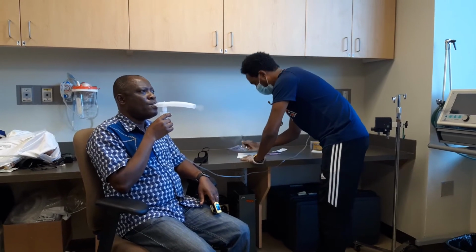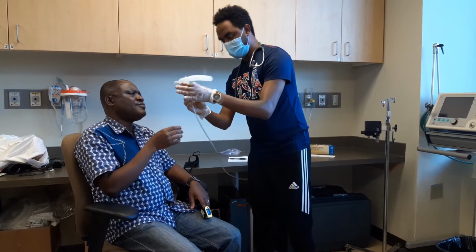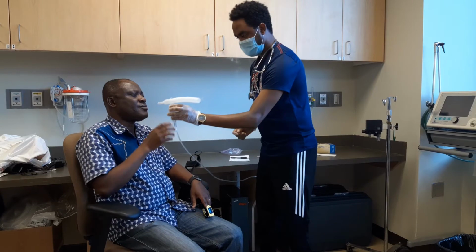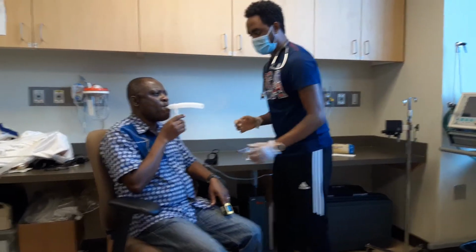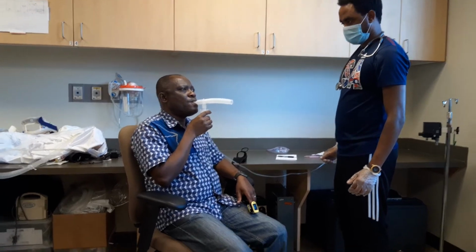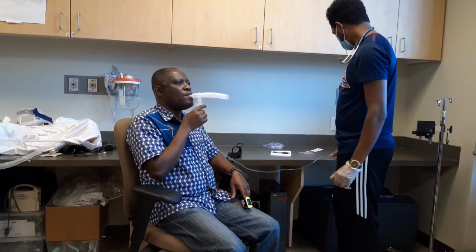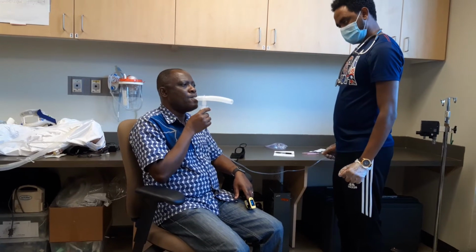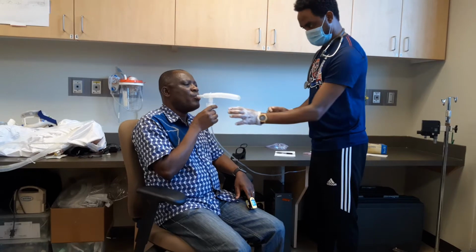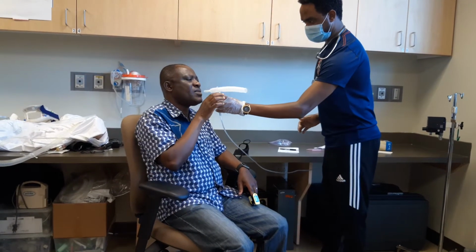Just breathe normally, and in between keep deep breathing, okay? Alright, tap again. We're almost done.